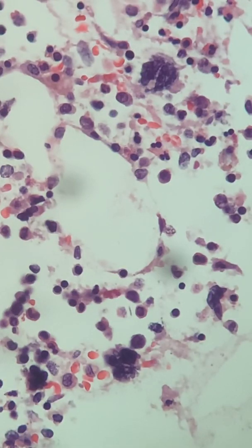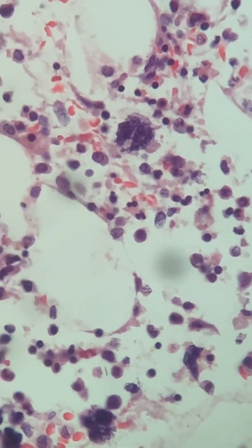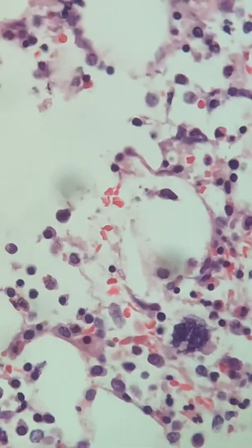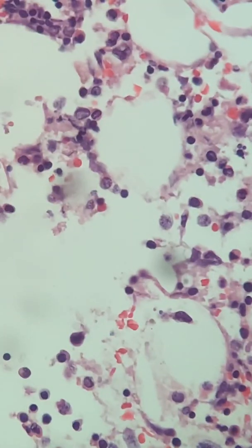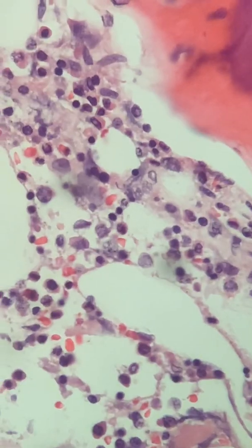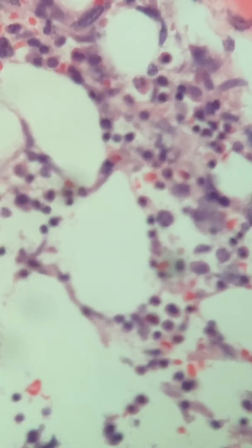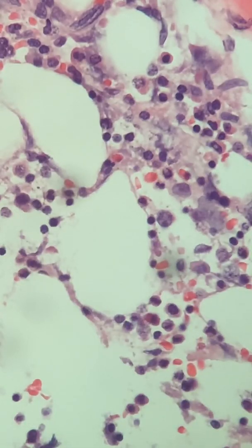I think you just see, every now and then, if you go to a good area, you'll see a collection of megakaryocytes. But in this, it's not like overwhelming close together megakaryocytes. As we go in several other fields, you don't see any megakaryocytes. Okay? I'm just trying to teach. I hope y'all are getting some stuff from this, because a lot of times even medical students don't get this much information. But this is beautiful cytology and histology.